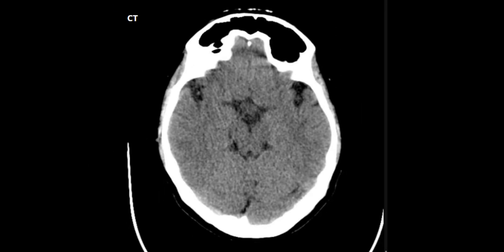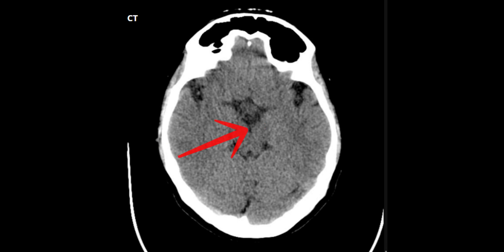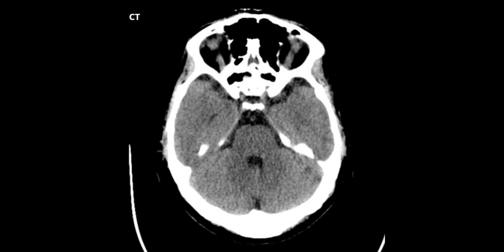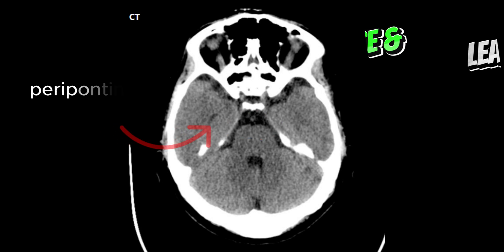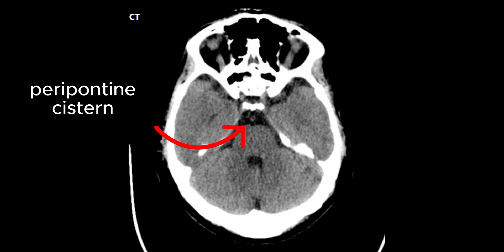This one lying between the peduncles of the midbrain is named accordingly as the interpeduncular cistern. Moving towards the base of the brain, this is the peripontine cistern as it lies around the pons.